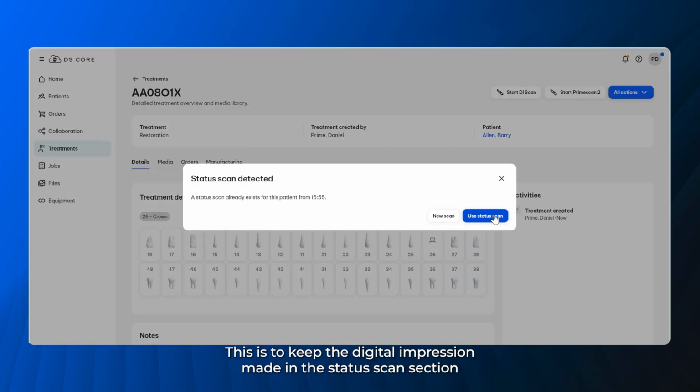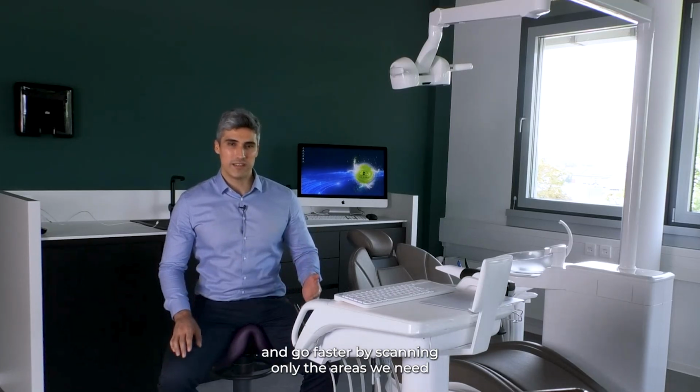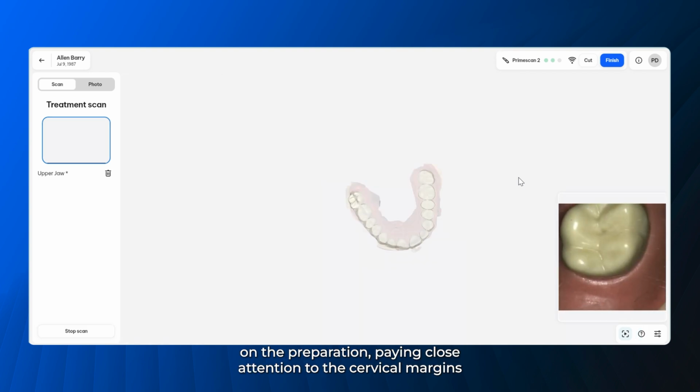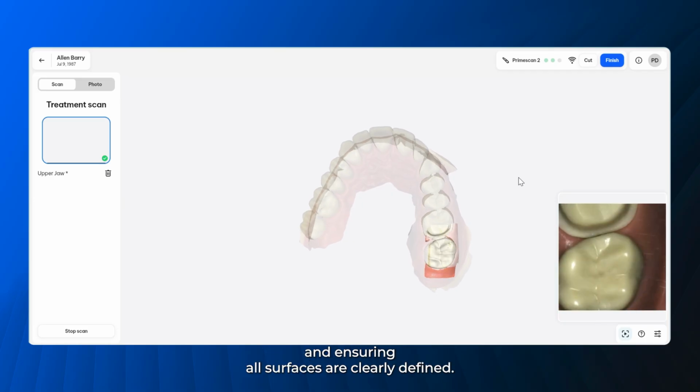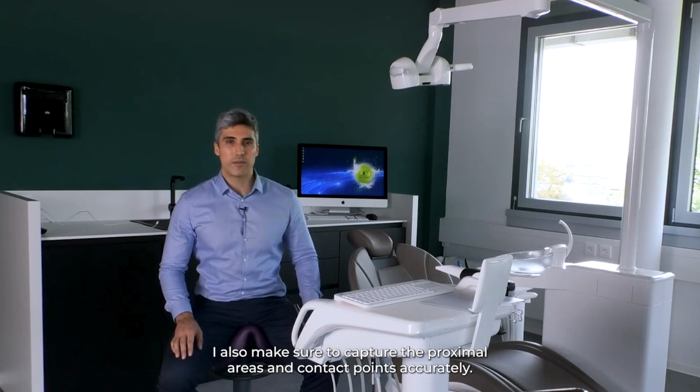This is to keep the digital impression made in the status scan section and go faster by scanning only the areas we need. Since I'm using the existing status scan, I can fully concentrate on the preparation, paying close attention to the cervical margins, and ensuring all surfaces are clearly defined. I also make sure to capture the proximal areas and contact points accurately.